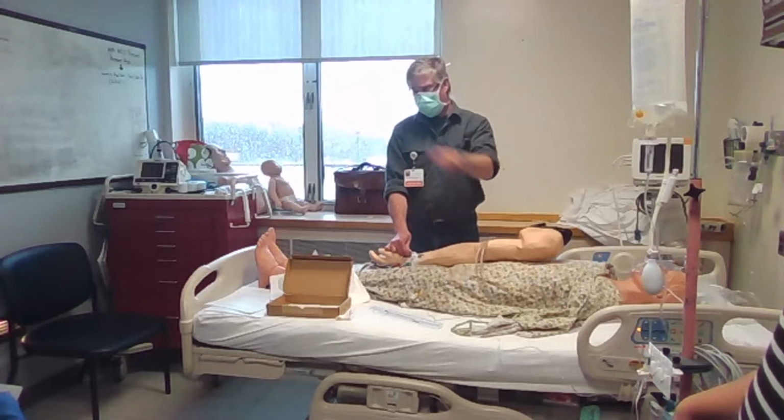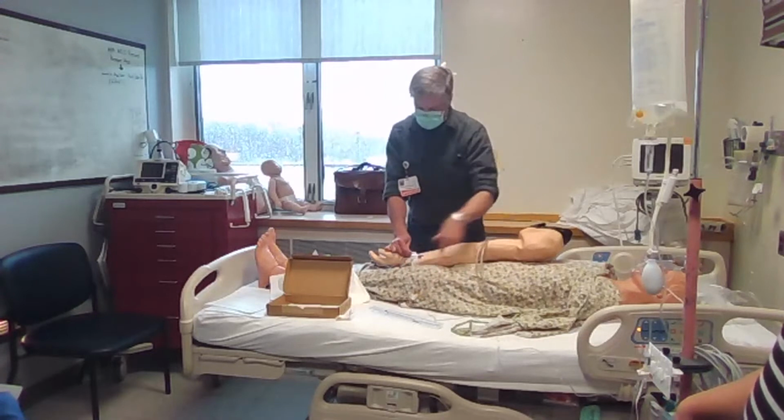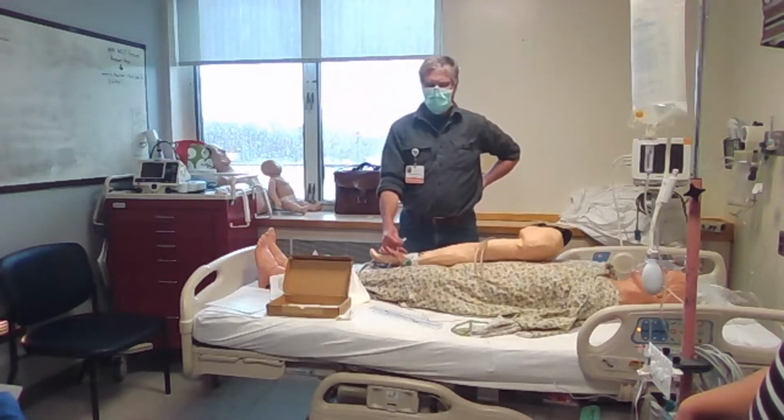And then you immediately flush the line after, because you're going to have blood in here. So you flush the line until it's clear, and then you're good. And those are like the two biggest troubleshooting things to really think about.